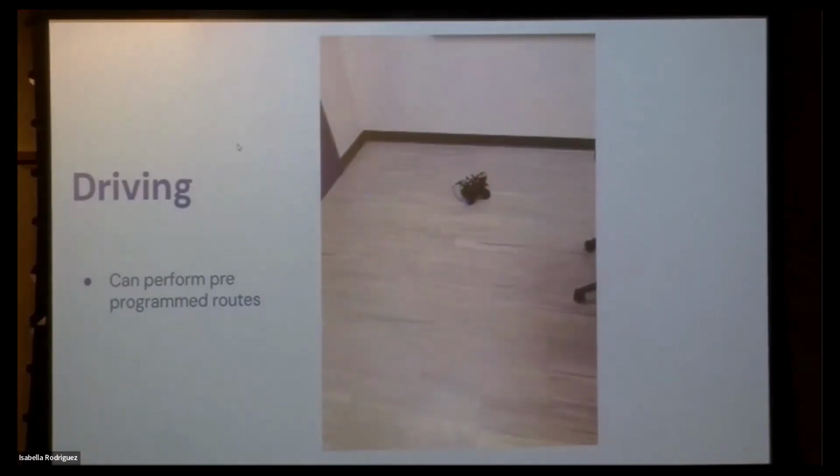We also had a video of our robot driving around the room on a pre-programmed route, not fully autonomous, just to demonstrate that our hardware, our Raspberry Pi outputting to the Arduino, outputting to the motor controller, all of that was working great. But you'll have to imagine it.